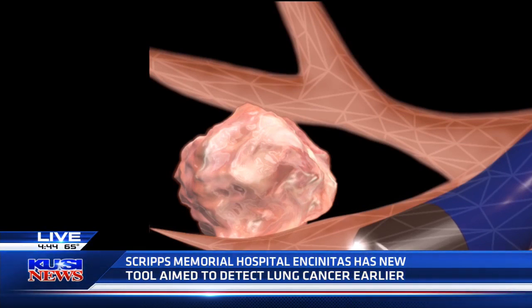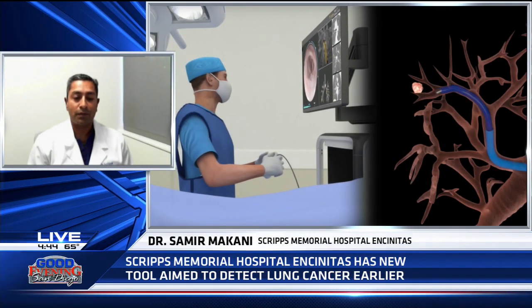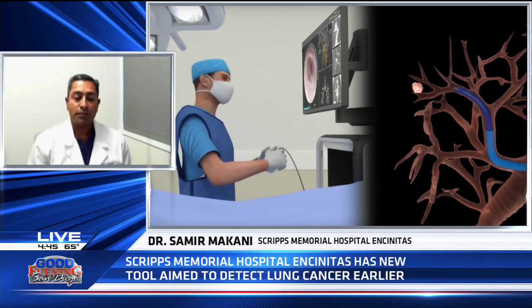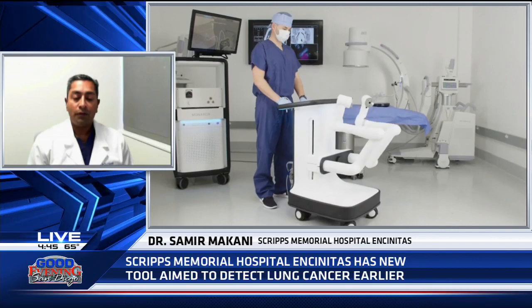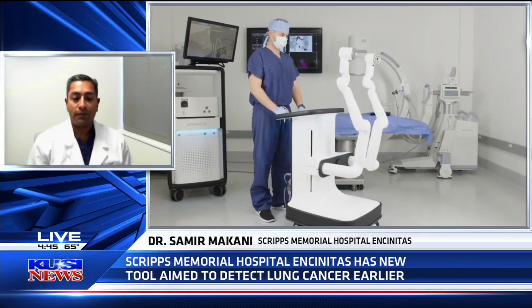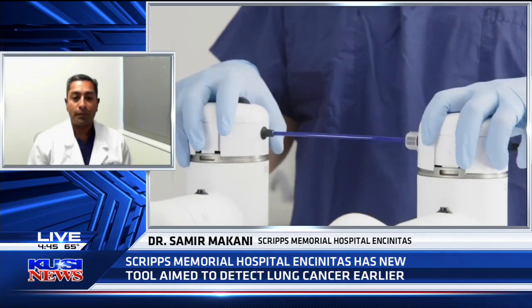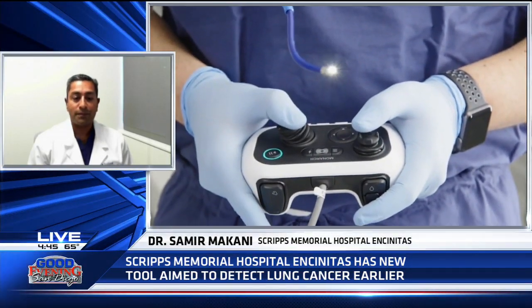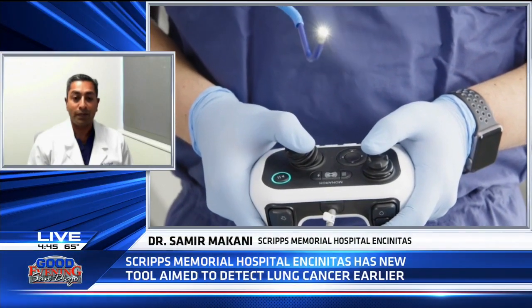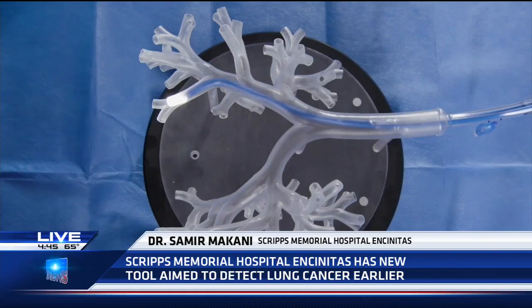Right. So traditionally, when we've done these procedures and the actual taking of the tissue via biopsy or placement of a needle, this has been done with the use of X-ray, and that's a two-dimensional technology. So with the use of CT scanning, we're able to visualize in 3 dimensions exactly where we are, and this is to help us improve accuracy and ensure we're biopsying the exact location we intended to.